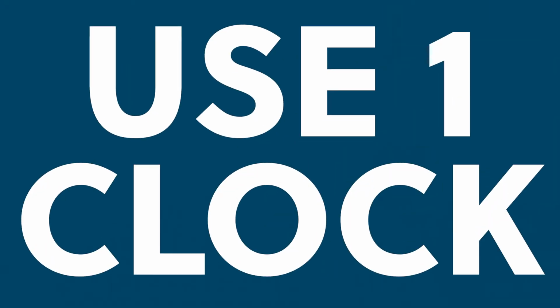Additionally, when you're determining things like time of death or when resuscitation began, please use one time source. And I say this because sometimes people's watches are set slightly differently. The clock in your ambulance may be slightly fast or slow. You want to make sure that all of your documentation makes sense with the times. So use one time source as your point of reference. I think that's been a good pro tip.